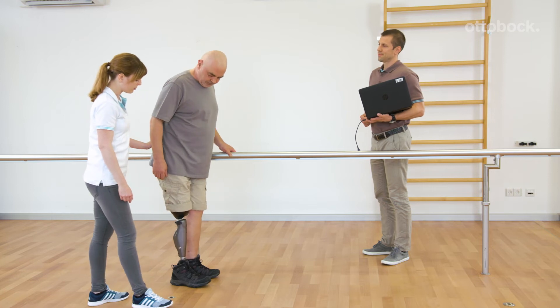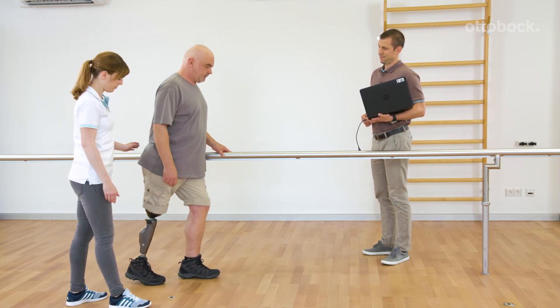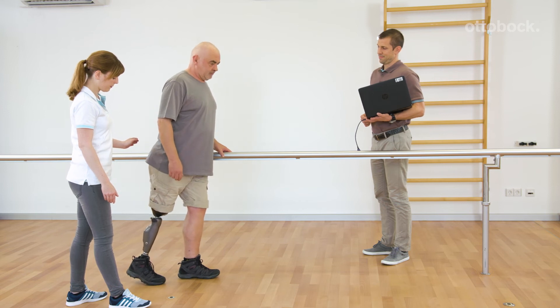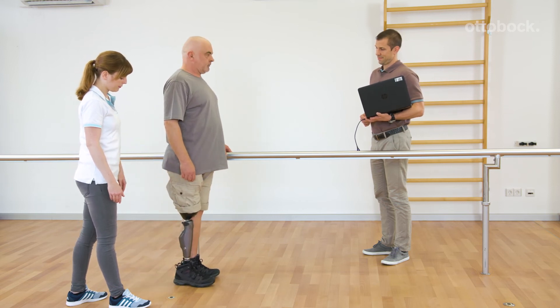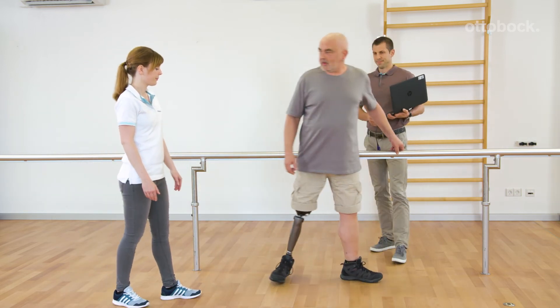Take care that the knee joint is extended during bouncing. The switchover happens after the foot is placed next to the other. If the beeps for confirmation do not happen, the switchover wasn't successful.